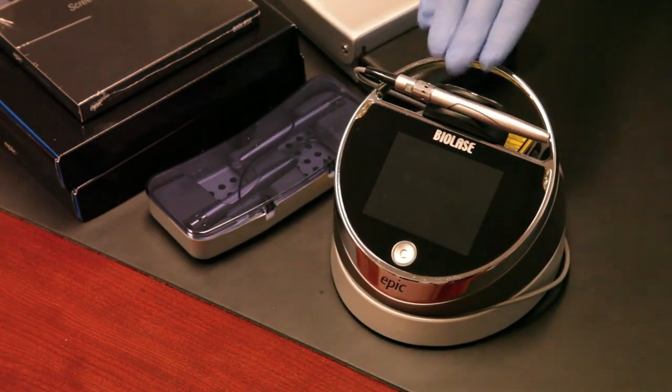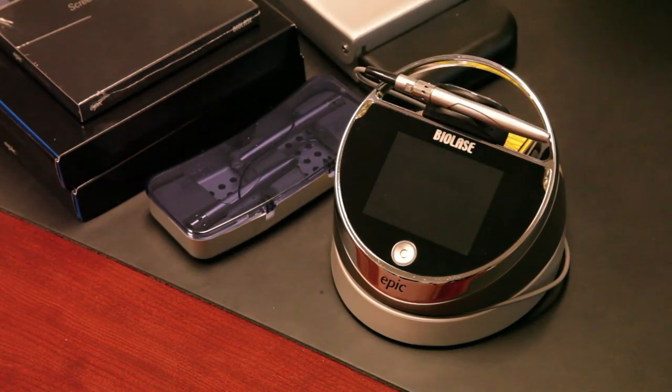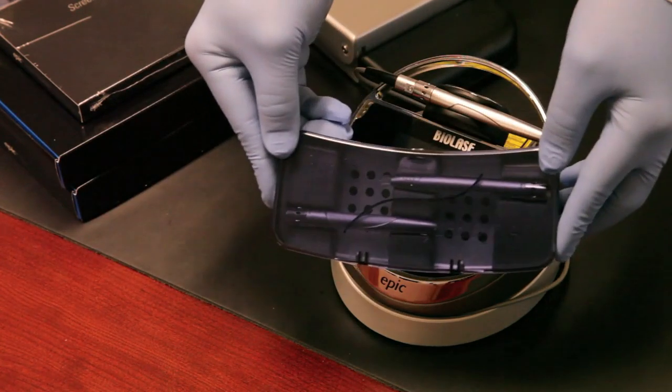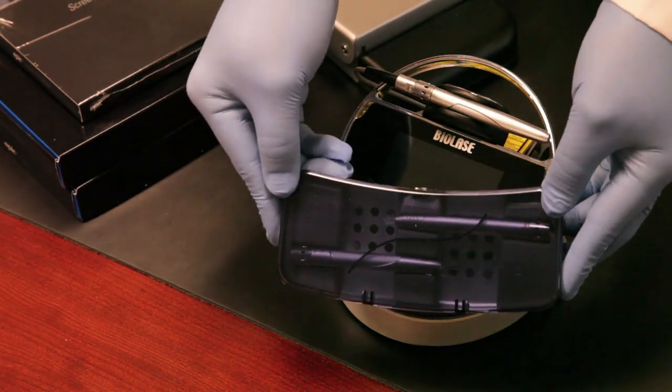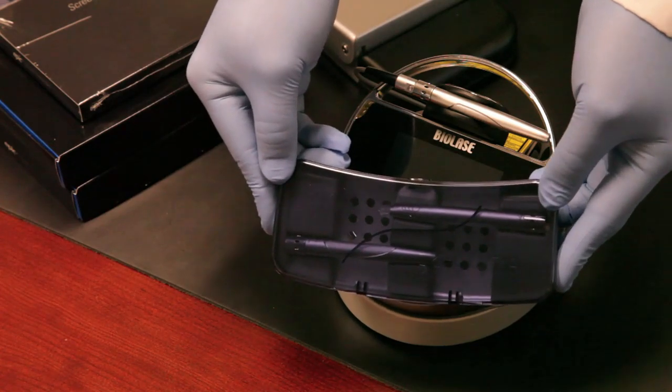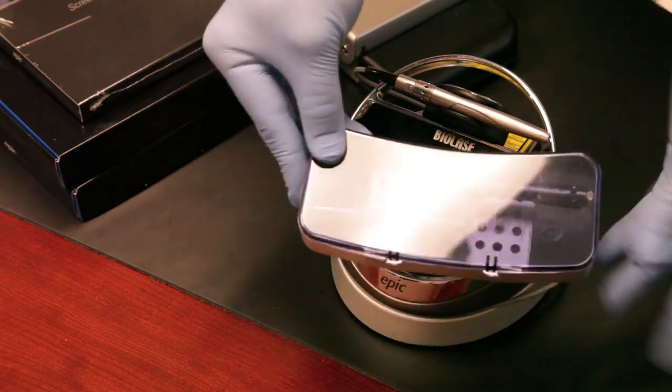We'll turn it on in a moment and go through some of the controls of the UI. In addition to the laser, in the box you'll also receive two surgical handpieces. We'll show you how they go on and off and how easy they are to keep clean with your autoclave.